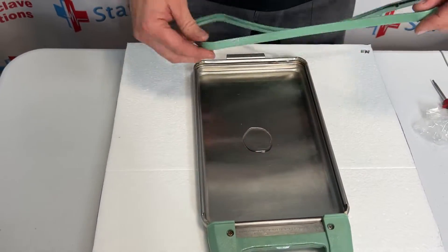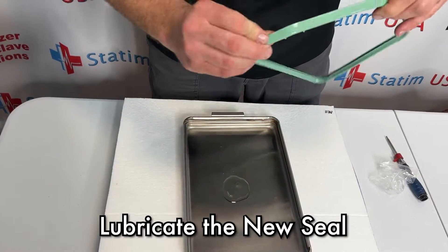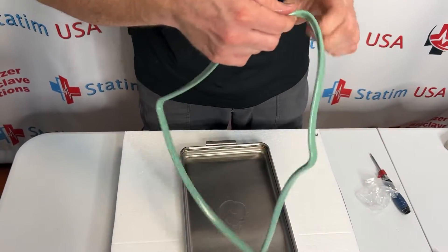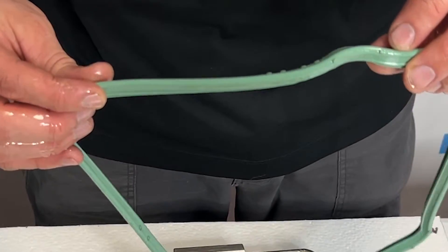With our new seal, take a couple of fingers and we are just going to lubricate this entire seal, going all the way around it. You will see that there are two holes in the cassette seal and some nubs sticking up.